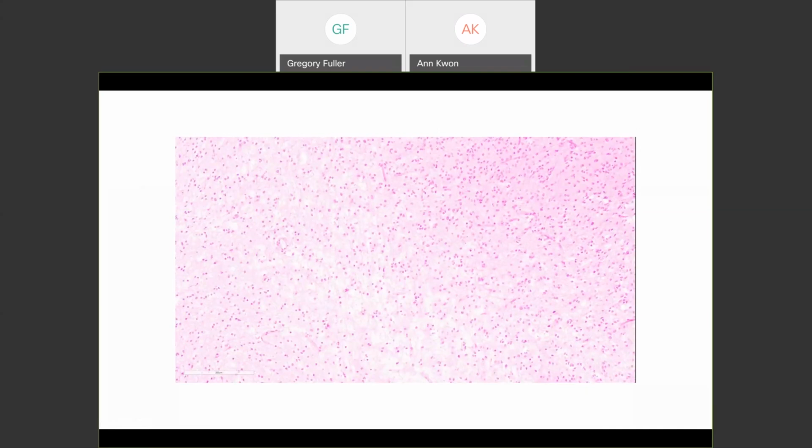It is a diffuse glioma. What does the morphology look like? Yeah, thank you. An oligodendroglioma. Why? Because the cells are regular, round, monotonous, and even though the histology, it's an outside case, is suboptimal, you can see halos around some of these nuclei. If you look at an area like this, I can see halos there, some here. Yes, oligo has to be probably number one on your list. Then you could go with astrocytoma. Is it absolute? No, it's not absolute, but it's very suggestive.